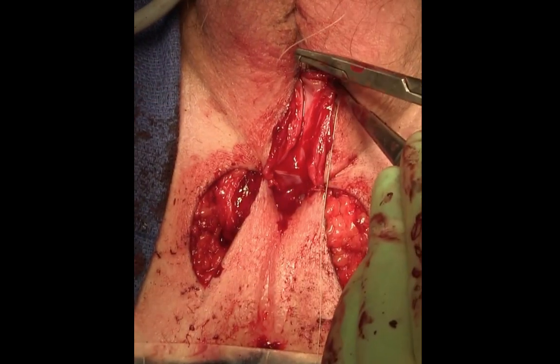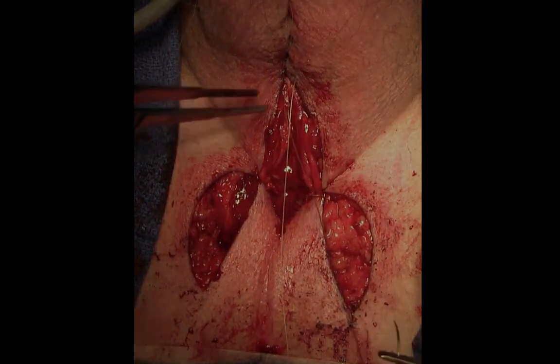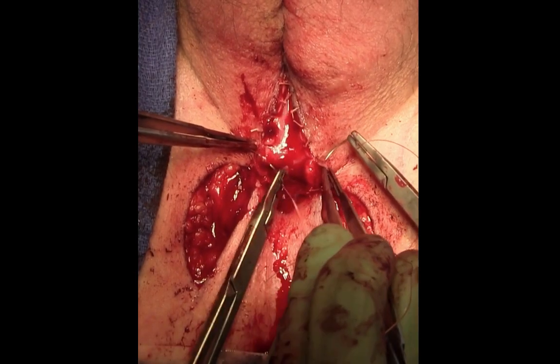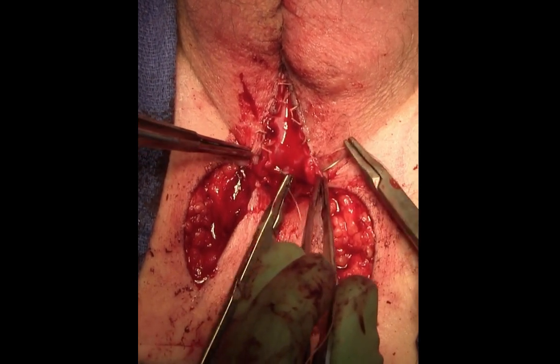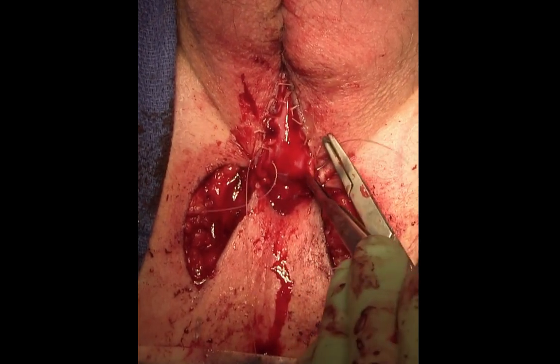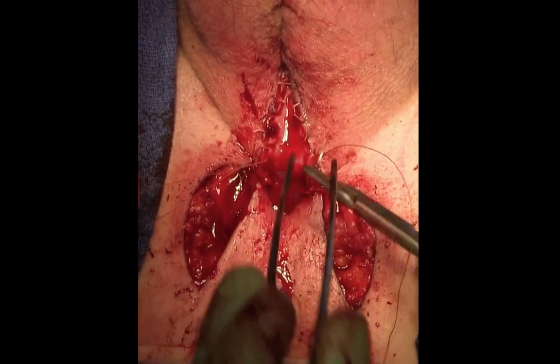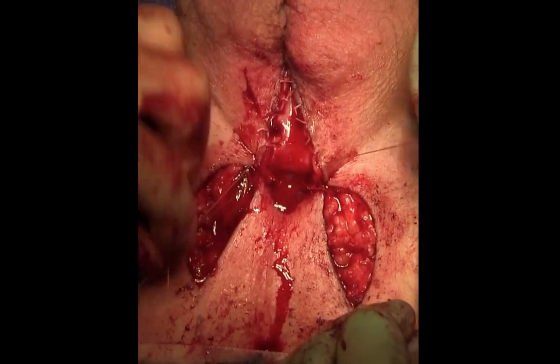Again, to mature the skin to the urethra, it's very important to incorporate three layers: the cut edge of the skin, the cut edge of the adventitia of the corpora spongiosus, and the urethral mucosa. 3-0 Vicryl or 4-0 Vicryl is used to mature the perineal urethrostomy.